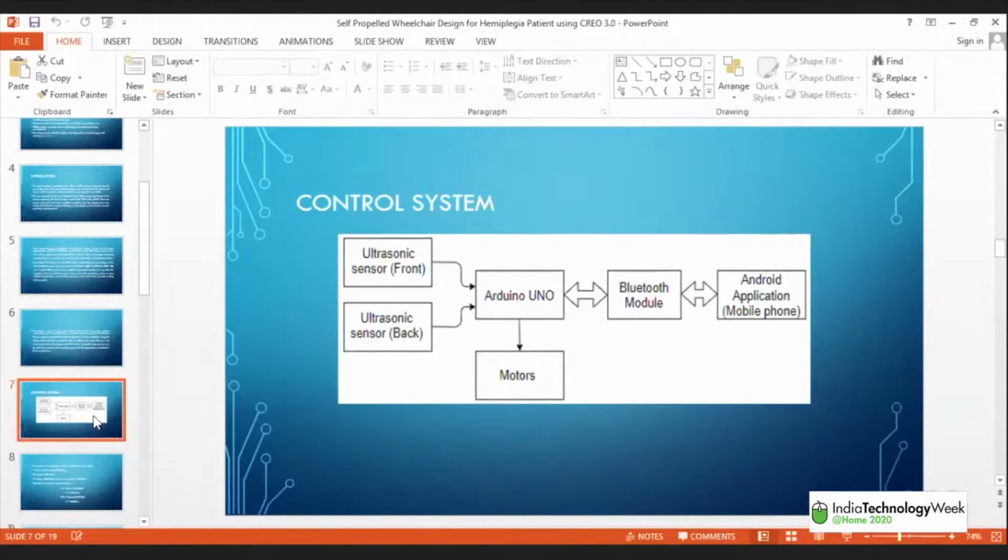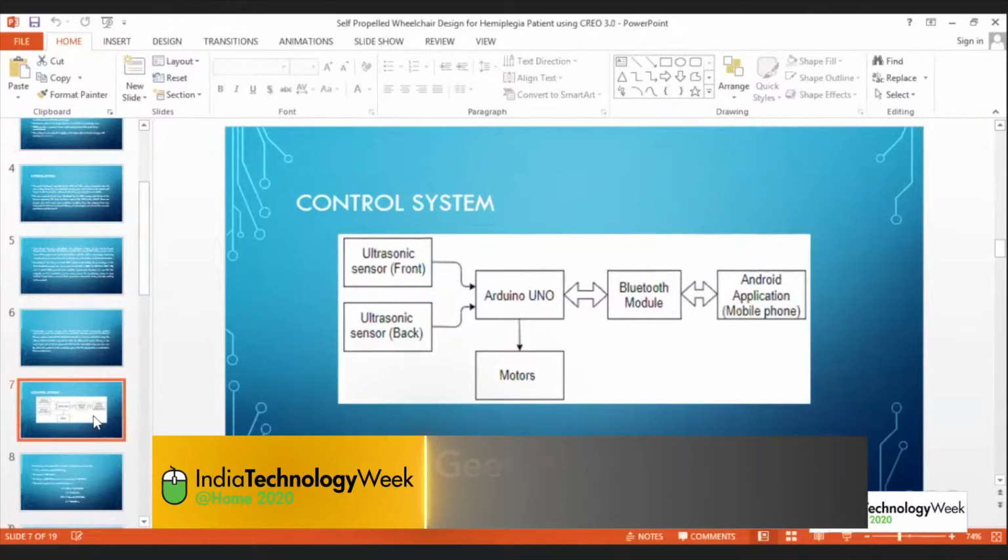Now, this specific distance is programmable. So I may go for a distance of 30 centimeter. You may choose a distance of 60 centimeter. Either way, it is going to work, because you just need to go to the program and change the value over there based upon your house calculations. You can always alter it, right?